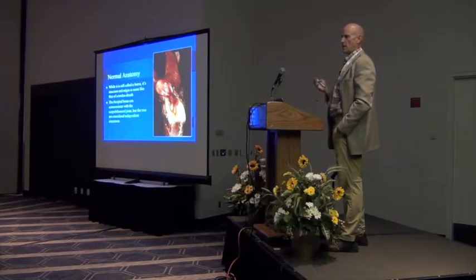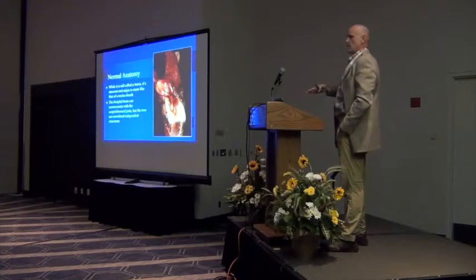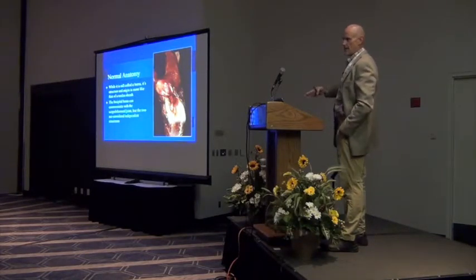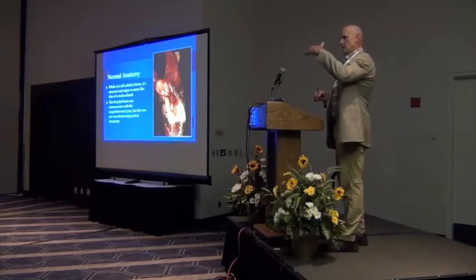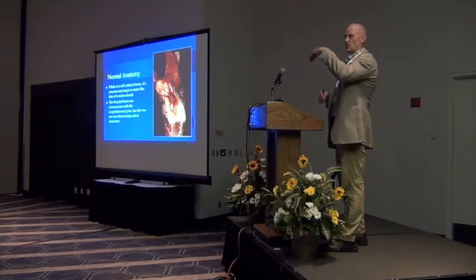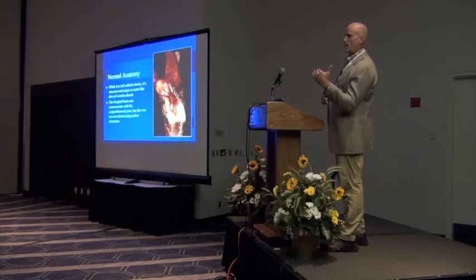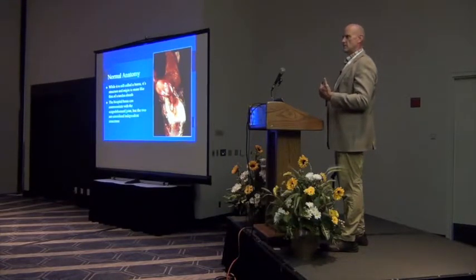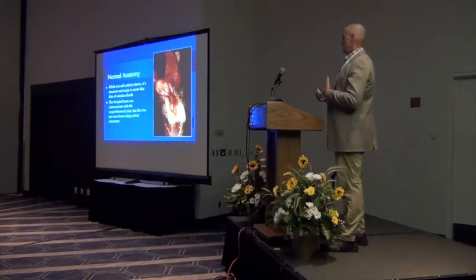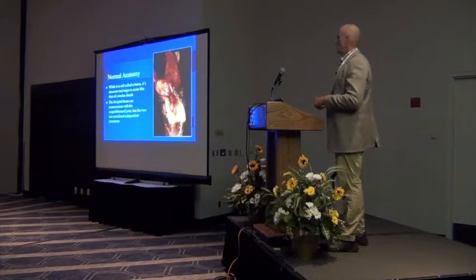intertubercular area. And the thing that I want you to remember, and I'll emphasize it again, as the biceps comes around, it changes and fulcrums around that intertubercular groove and then comes back. So if you follow the principles of ultrasound, beam angle at 90 degrees to the fiber pattern of the structure you're looking at, you have to change your beam angle as you go all the way around. And that takes a little bit more effort to get a good scan, and don't feel like it's a problem that you're having getting a good image. You just have to work the image really hard.